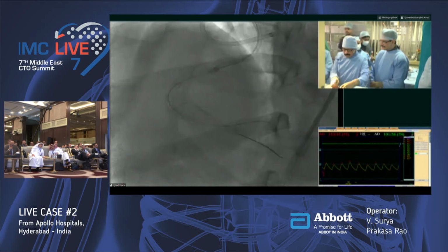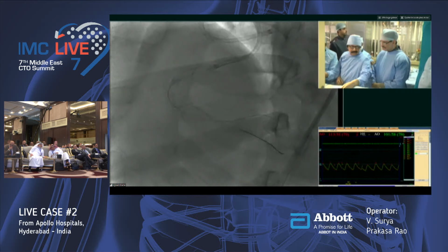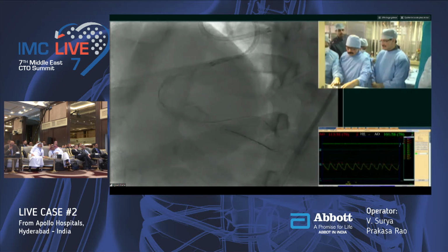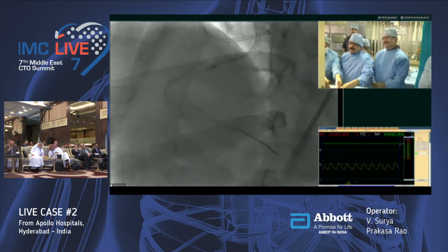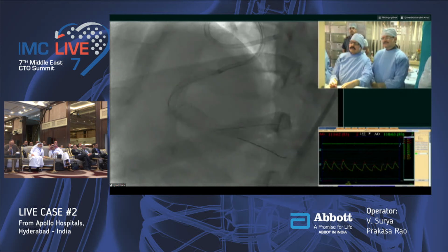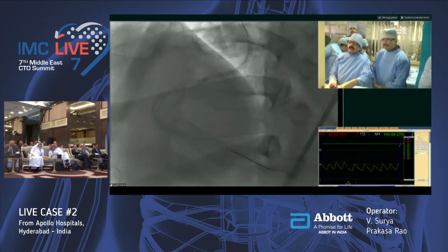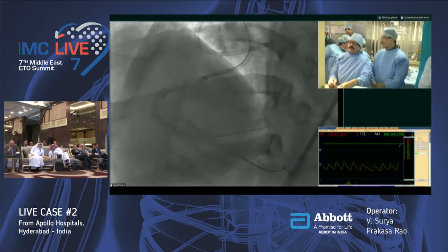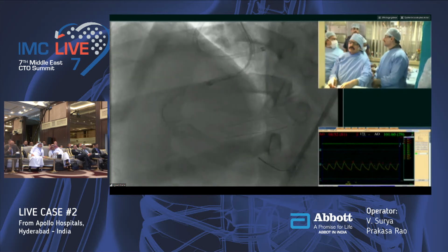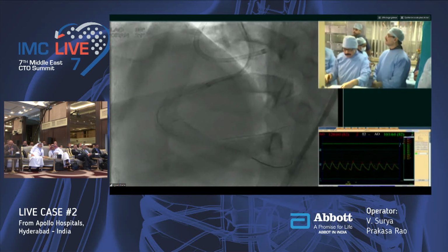Kissing, final kissing we can do. First dilate the PLB. So now you plan to use a balloon? Yeah, balloon dilatation for the PLV ostium. Which one? PLA. Okay. What balloon? This one. For anything, take 1.25. Tazuna 1.5 mm balloon. Yes, you can take. Okay.